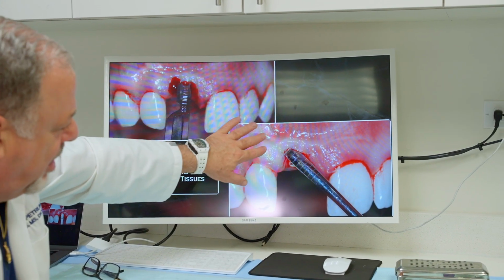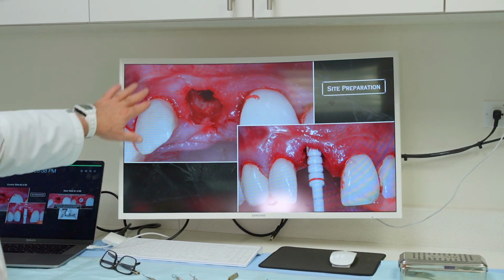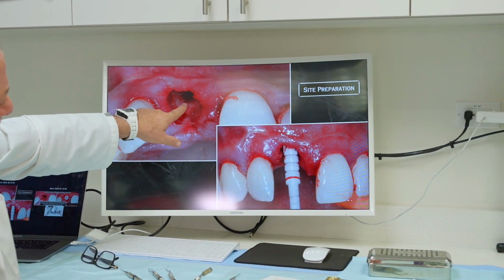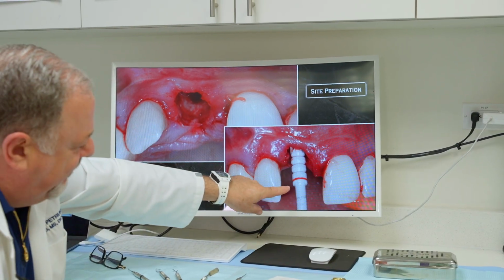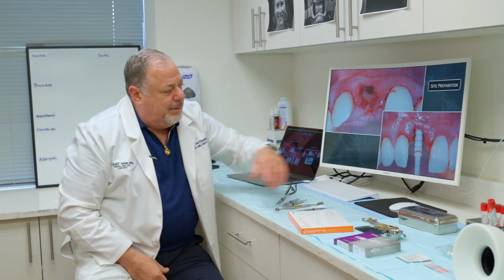So we're going to be freeing all of this up without freeing up across that facial aspect, okay? So now this is loose. I'm widening up my site here, okay? This is a 2.85 Z-Systems ceramic drill, and I'm planning on going to a 12 millimeter implant.